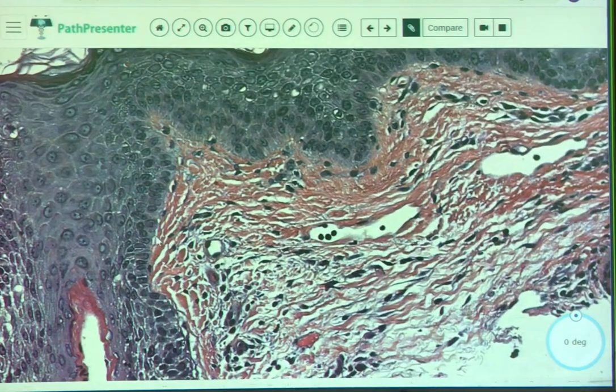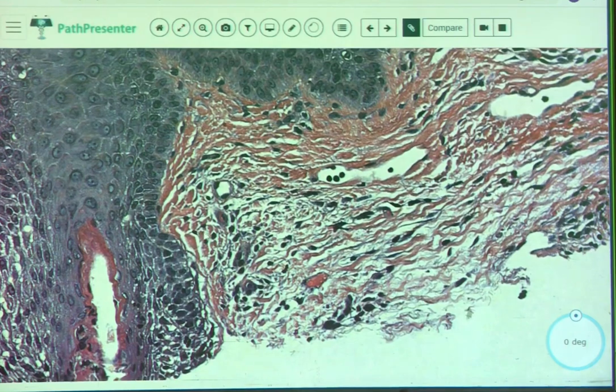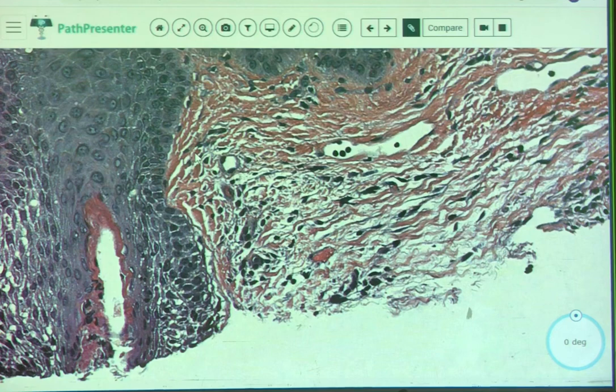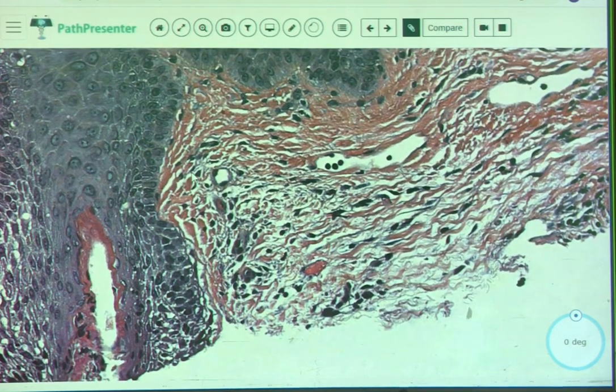Yeah, it was more normal there. But these are the kind of things that you're looking for in skin lesions. These are the kind of things that we will hunt for on the sides. If we're not looking for eosinophils, we're looking for stuff like this. So with this sort of atypia, any ideas what we're looking at? We're in sun-damaged skin. It's a flat lesion. Actinic keratosis? Bingo. This is actinic keratosis. So it can be very subtle atypia.